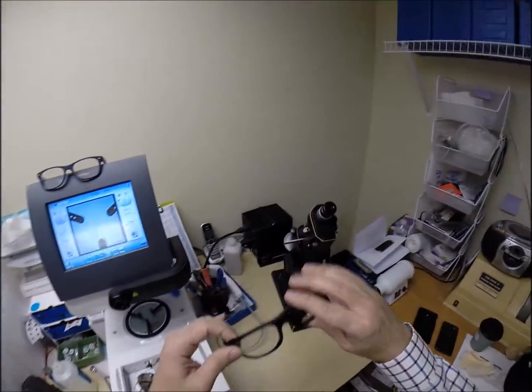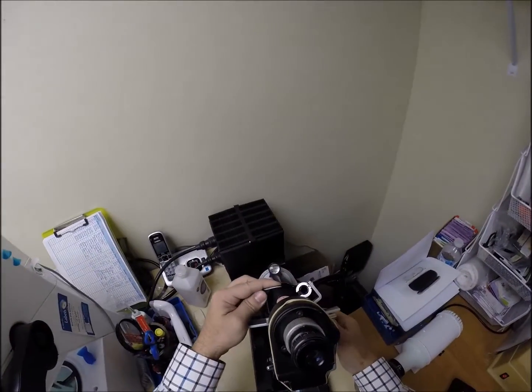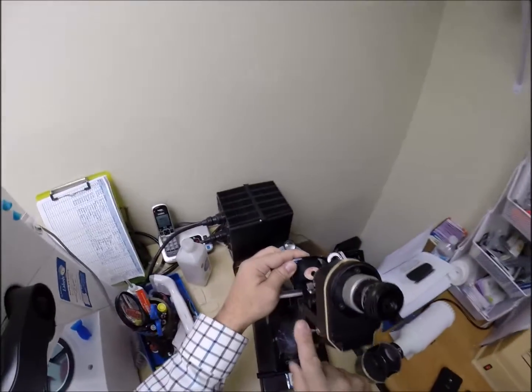Now, if these were prescription, I would come over here and read the prescription off in my lensometer. Of course, you got to turn it on.